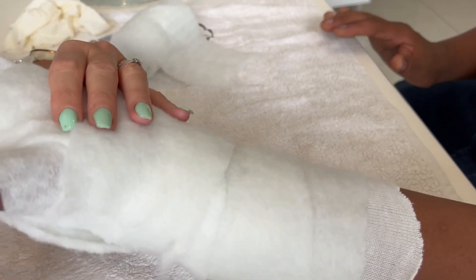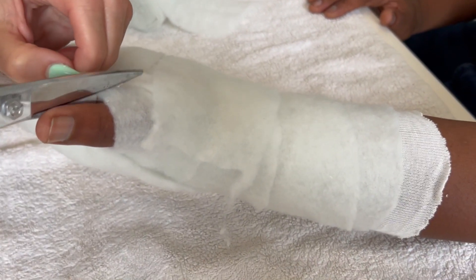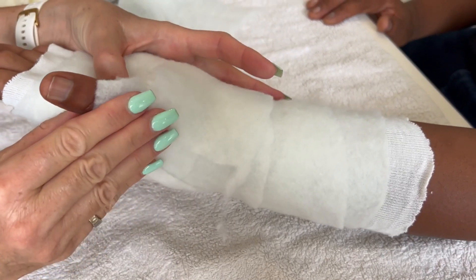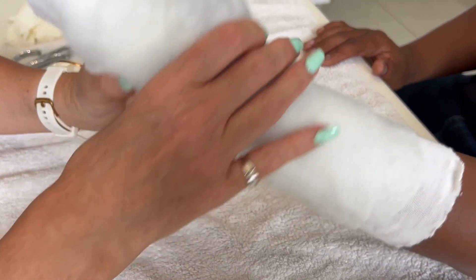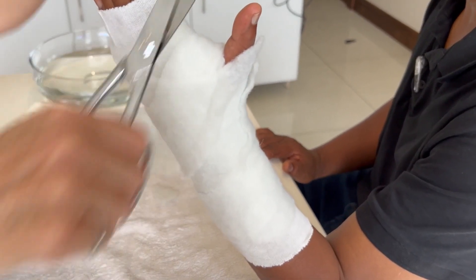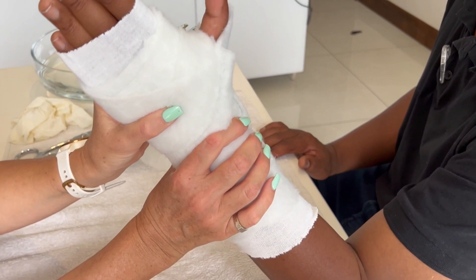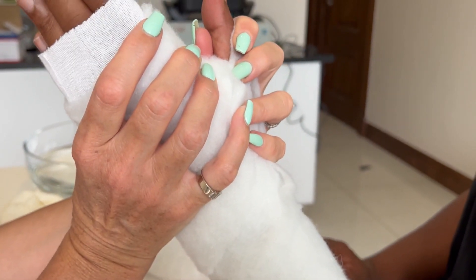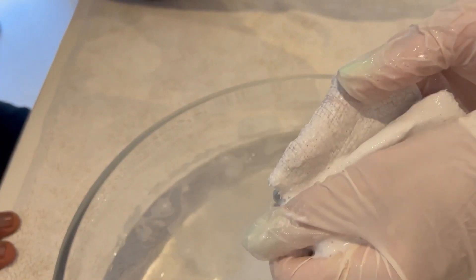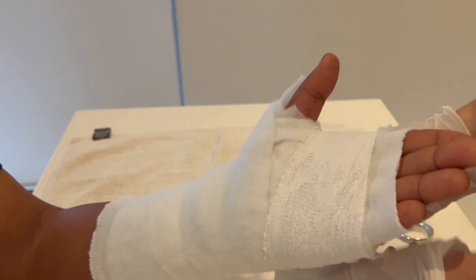You make sure that you free up where you want the joint to move — I'm going to cut this away here because I want the joint to move in that direction. Keep your elbows still on the table. We're also going to give you a little bit of wrist extension — just a little bit — and then this thumb will come around. The plaster of Paris goes in the water, squeeze out the excess water, and then we go in line with where our stocking net is.